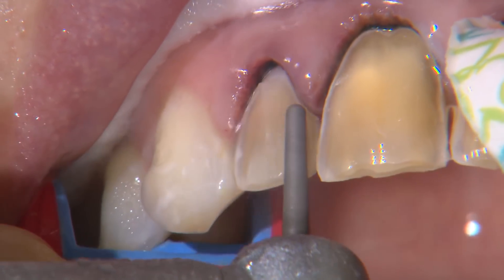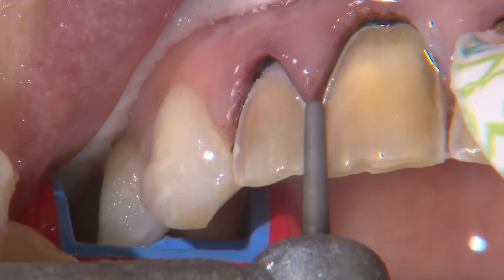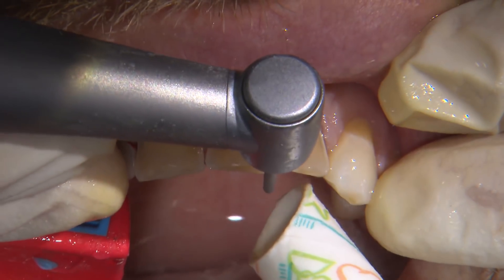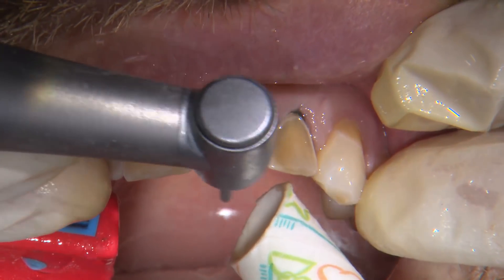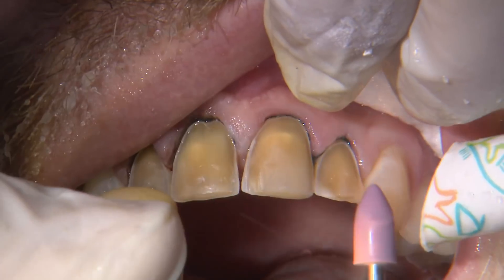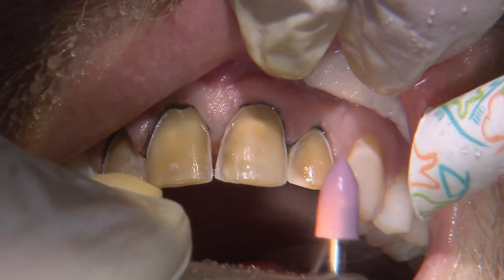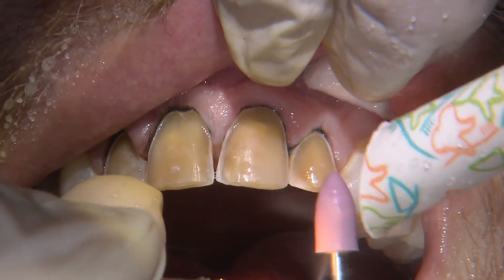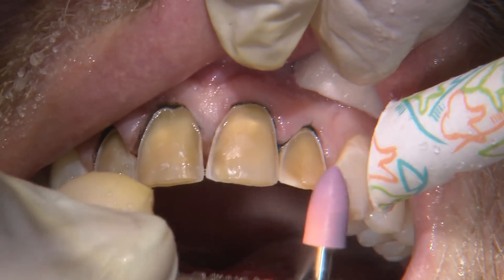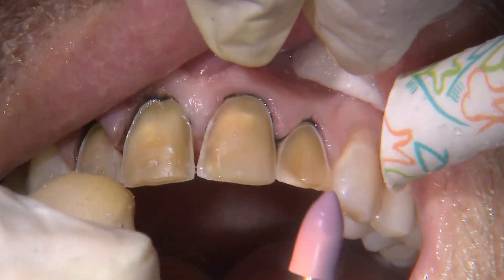To follow the mesial-to-distal curvature of the anterior teeth, I run the tapered diamond bur approximately to a depth of about halfway into the contact area. We are planning to lengthen the teeth, so I flatten the incisal edges and terminate the margins at the incisal-lingual junction to include the entire incisal edge within the preparations. As with any all-ceramic preparation, we want to round off any internal line angles for ease of fabrication and to ensure the final restorations are well adapted to the teeth with minimal internal stress. With these veneer preps, the main sharp internal line angle is found at the labial-incisal interface.